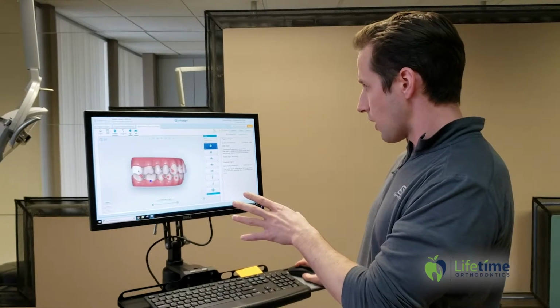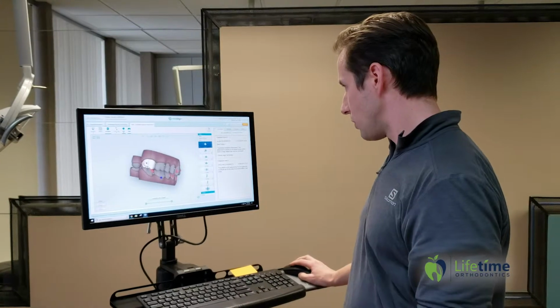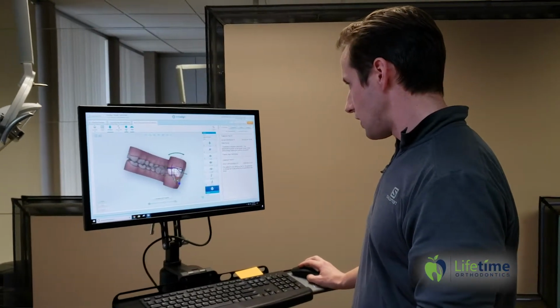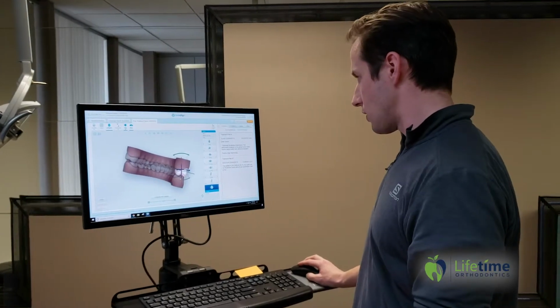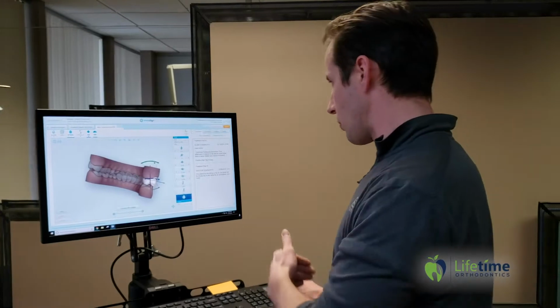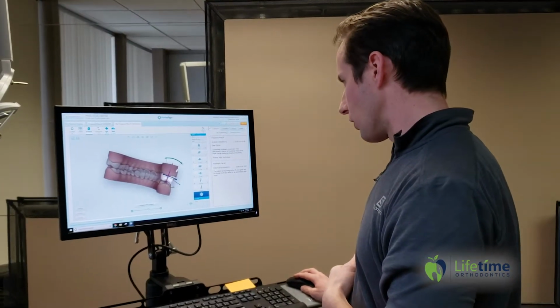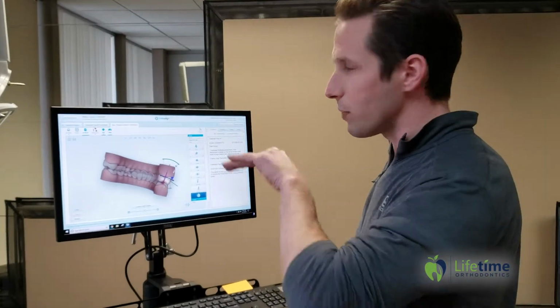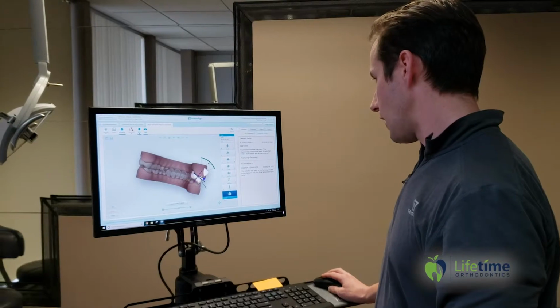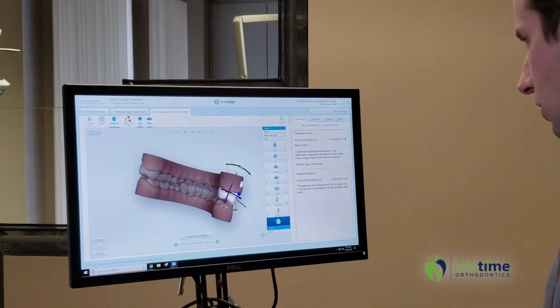And so what I do is I come in here, and I can move these teeth, okay? So I'm going to grab this tooth, and you can see from the back view here that this is a hanging palatal cusp, okay? So what I want to do is get that out of the way. And so I'm going to torque this root, we call it, and I go all the way, because the reality is it never really happens the way the computer shows. So I like to express that all the way, okay? So if I can get, that's a little extreme. Let's go right there, okay?